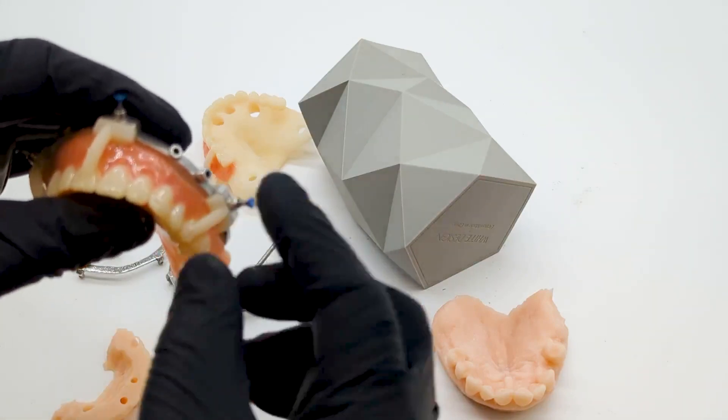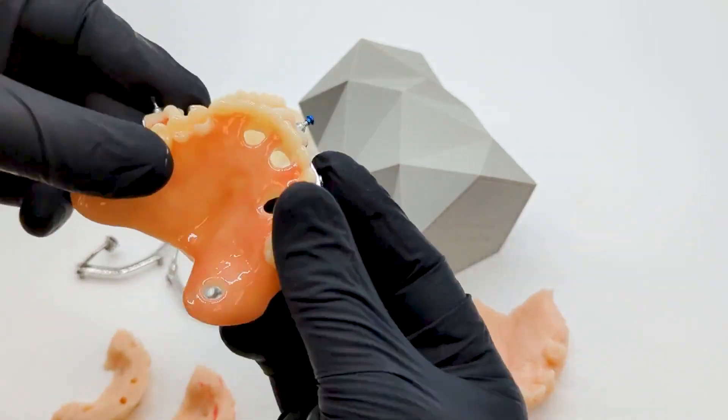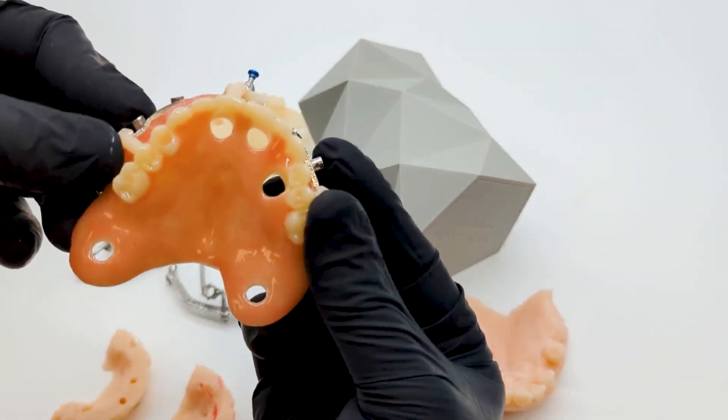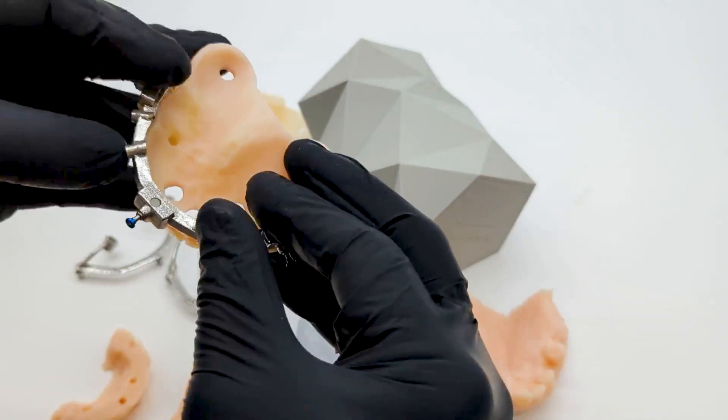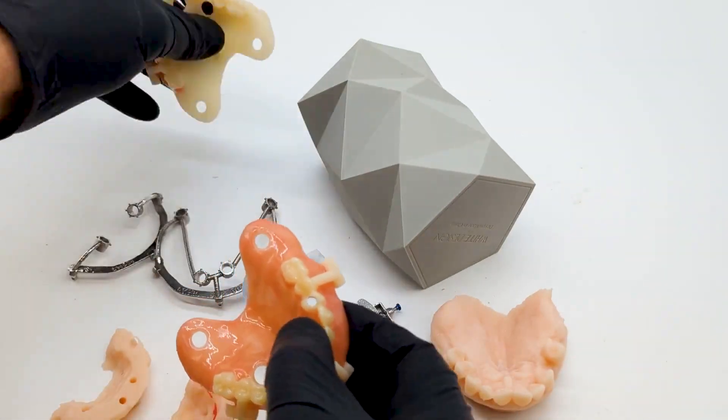Nice looking case here. Six implants there we go. And then as always, it's nice as a doctor will do two pickups. This is for the records. This is for the patient to wear home.